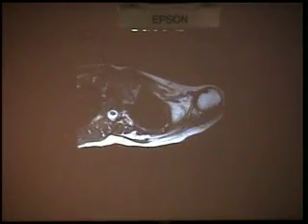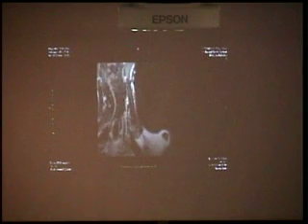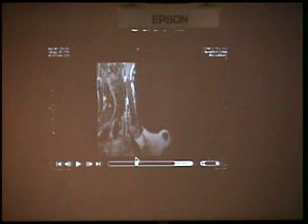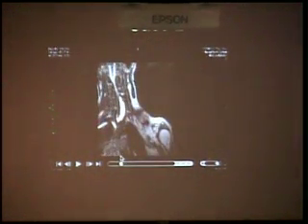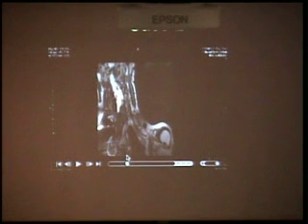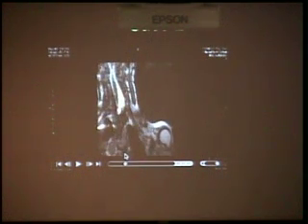Another trauma case. This one goes fast, but you'll start to see the abnormality in the spinal canal. And I've got some still images coming up. So there's a coronal reformat of those. Another great advantage of those SPACE images that I talked about is you can do reformatted images. So you can see in the spinal canal there's asymmetric T2 hyperintense signal in the left-hand side of the spinal canal.